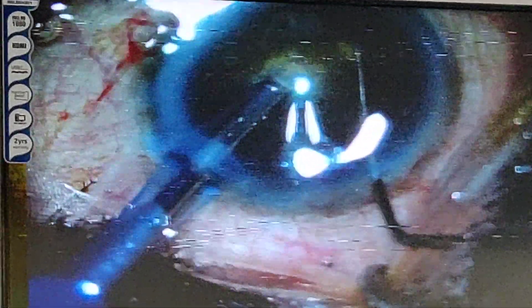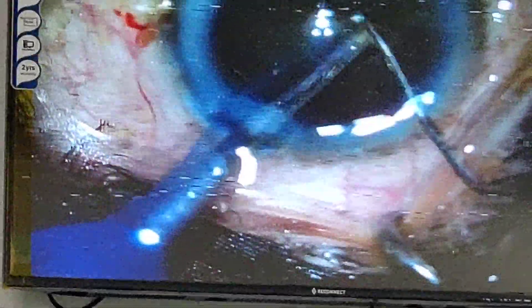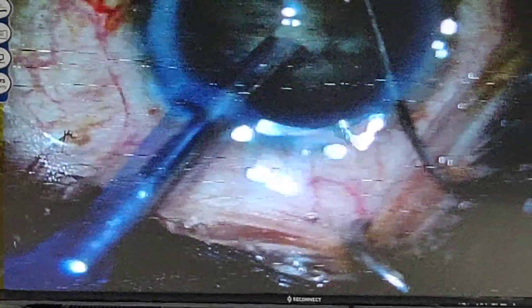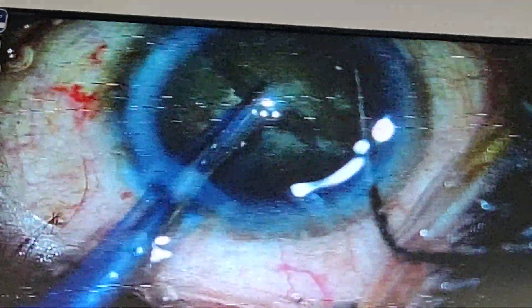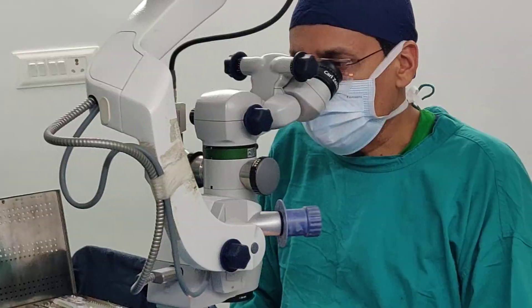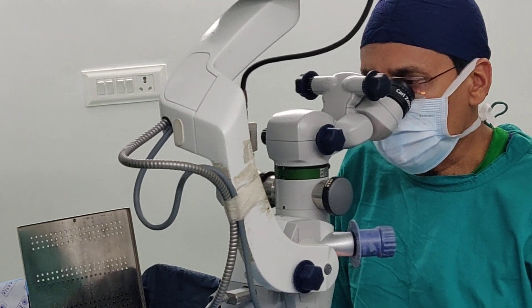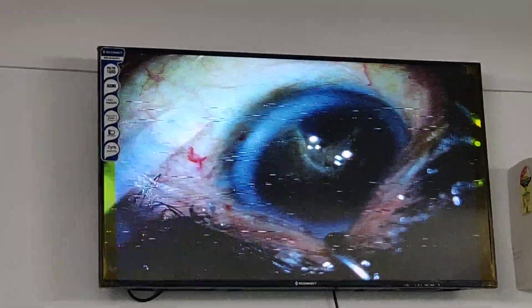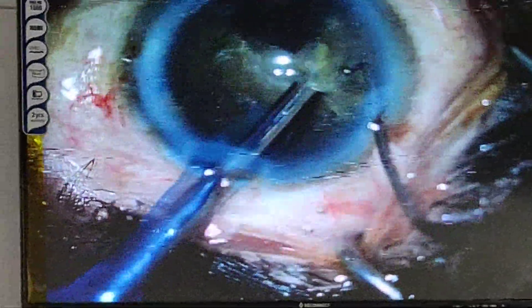The lens is engaged and you can see the beautiful two pieces — this is the horizontal chop. You can use the vertical chop also in this case, but I am using the horizontal chop technique. I am going to chop again, and this is the second piece which I am going to remove now.